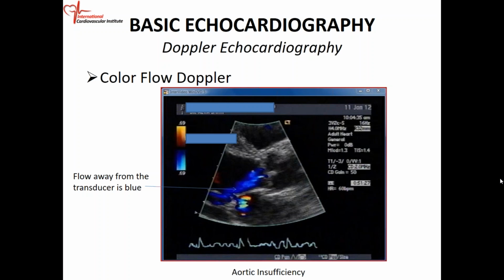Especially for people who are doing the exam, you're going to get a bunch of questions on Doppler. They always give you a bunch of questions. And another question is about the angle theta. Your echo is invalid if your angle theta is more than 20 degrees. You have to try and get that angle theta close to zero. Ultrasound beam should be parallel to flow as much as possible. Okay? You get maximum velocity if your angle theta is close to zero.